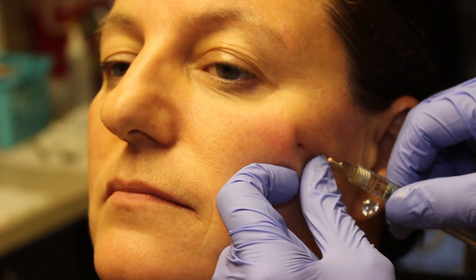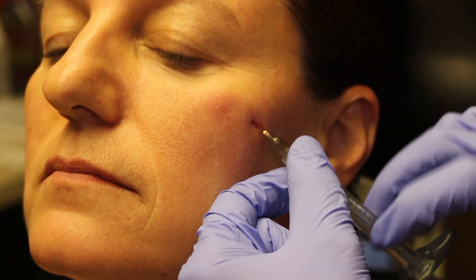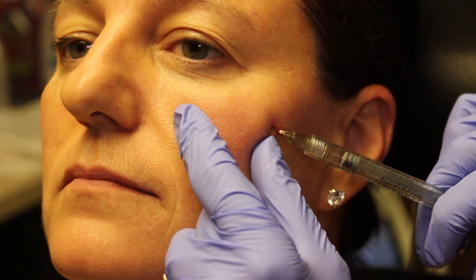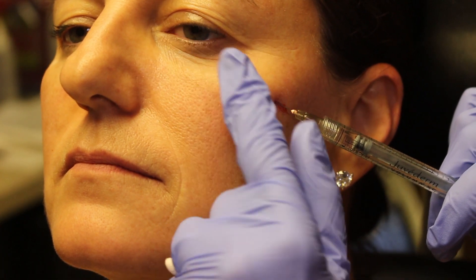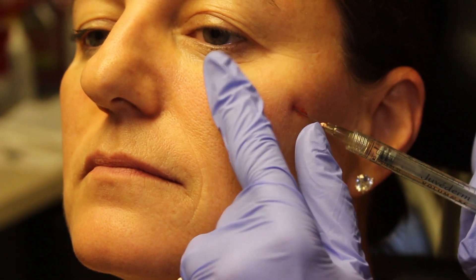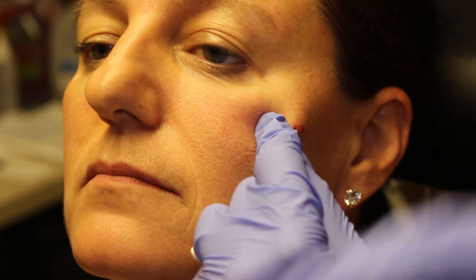I'm going to go this way — tiny little poke. Just gently, gently we're going this way. A little retrograde. It should not have a lot of bruising. It should not be painful at all.